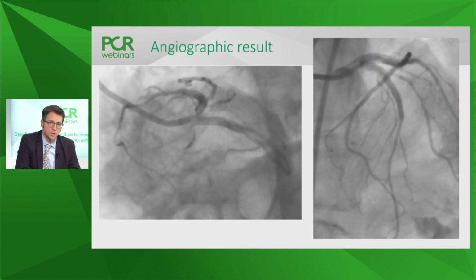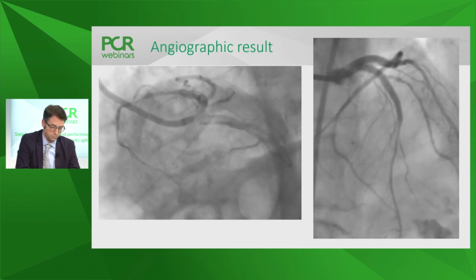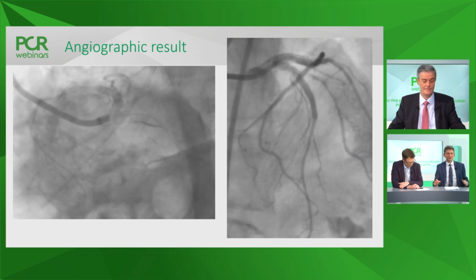And so here we have the angiographic result. It again looks angiographically beautiful. Would you accept this, or? Yeah, with the technique presented by Tom, I would definitely accept. But we all know that angiography may be misleading.